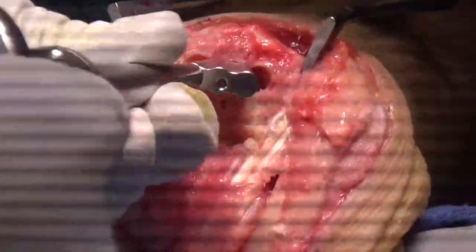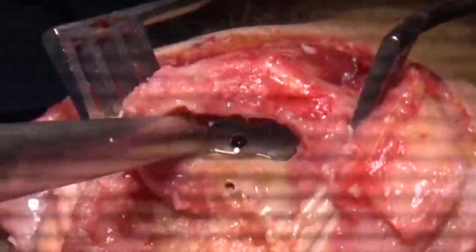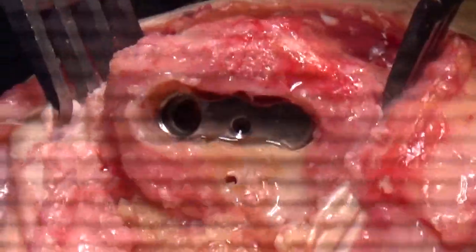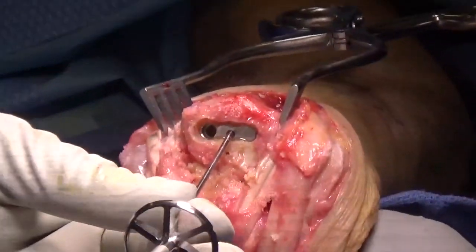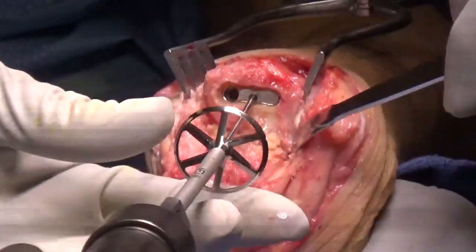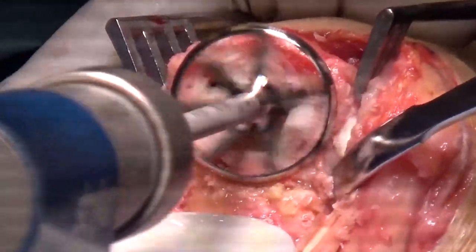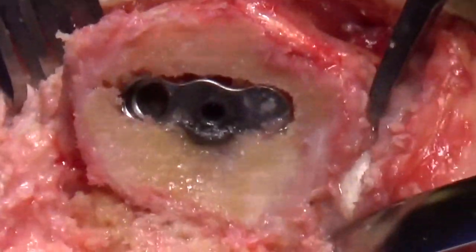The radial depth guide is then placed into the distal radius and inserted approximately 2 millimeters below the joint surface. A guide wire is placed, and then the radial surface reamer is used. This is used to give a very good anatomic fit to the distal radius component. Next, the trial is placed. Again, note this was a size medium.